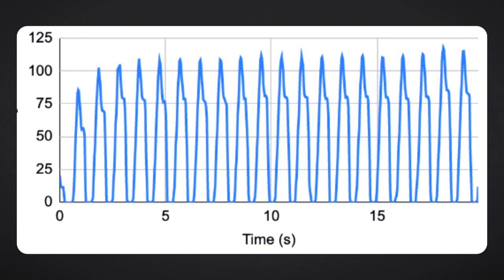It goes straight up and then it kind of has a soft release. It does that initial drop and then it drops all the way. And I think that is something that's really unique about the Medela Symphony. Just that softer downstroke can make for a more comfortable pumping experience. Just for reference, this is on vacuum level 9 of 16 in expression mode.